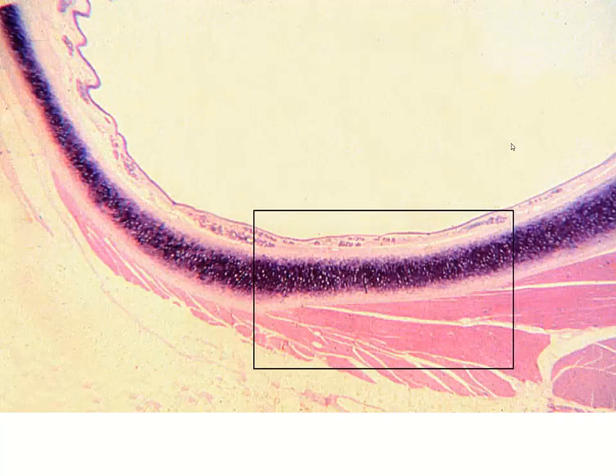Now we're shifting gears a little bit as we move into other types of connective tissue. Here I will go ahead and let you know we are looking in our respiratory system. We're going to have some muscle. This is going to be smooth muscle down here. We've got our cartilage. We have our connective tissue that underlies our mucosa and our epithelium. Now, when we talk about organ histology, and I'm already using terms we're not familiar with, but in organ histology, such as respiratory tract, digestive tract, our epithelium we're going to call the mucosa, and the connective tissue underlying the mucosa is going to be the lamina propria.